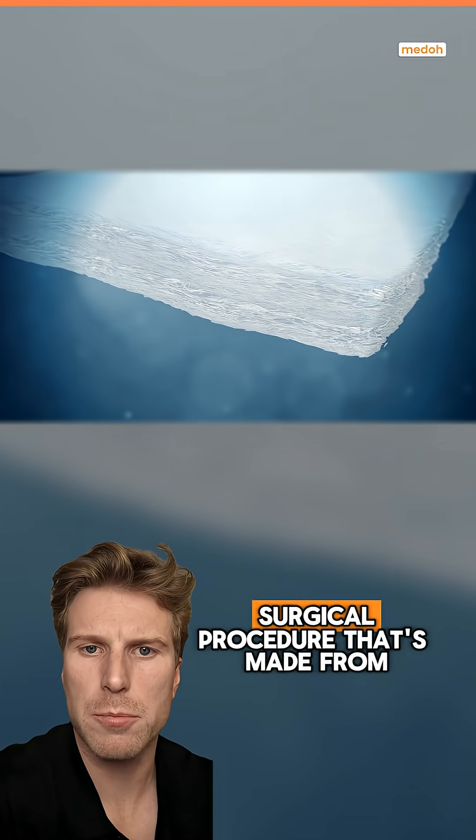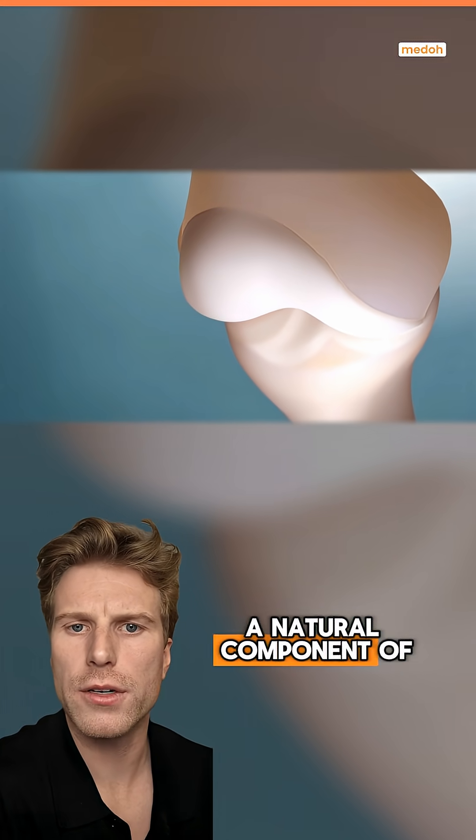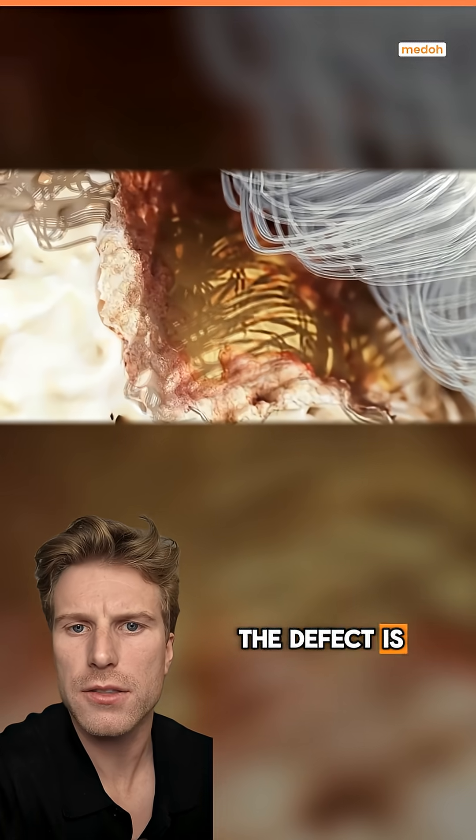Hyalofast is a surgical procedure that uses a 3D matrix made from hyaluronic acid, a natural component of healthy cartilage. It is placed over the damaged or injured cartilage and can be fit and customized depending on how big the defect is.